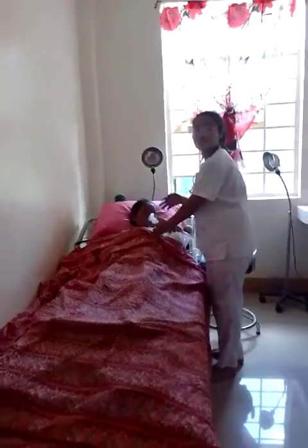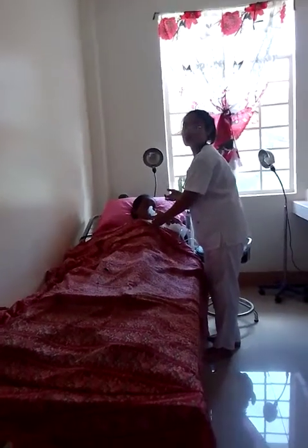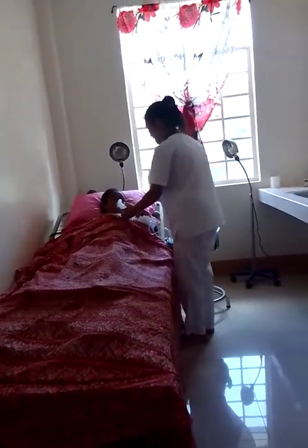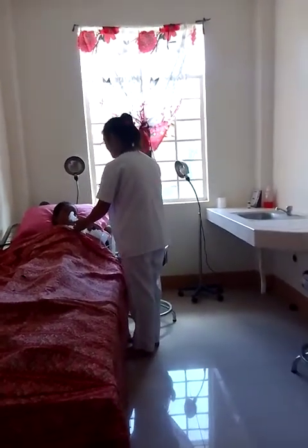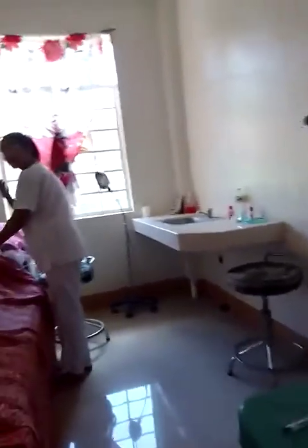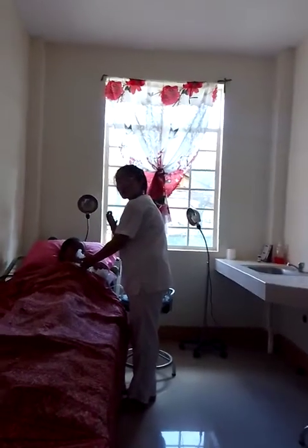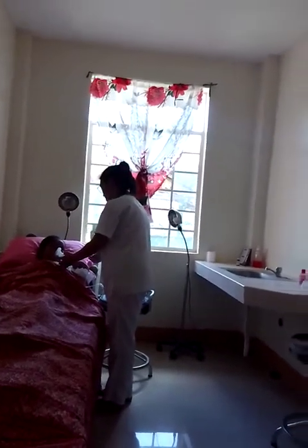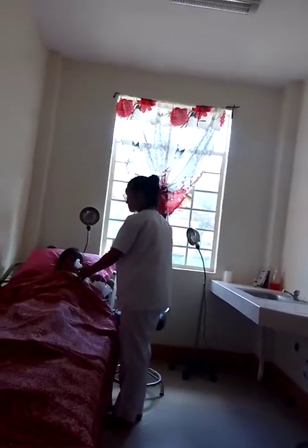And then the next one is we need to observe the expansion of the chest to ascertain that the patient is taking a deep breath. Sige ma'am. Exhale, inhale, exhale, inhale, until all medication is nebulized already. Exhale.